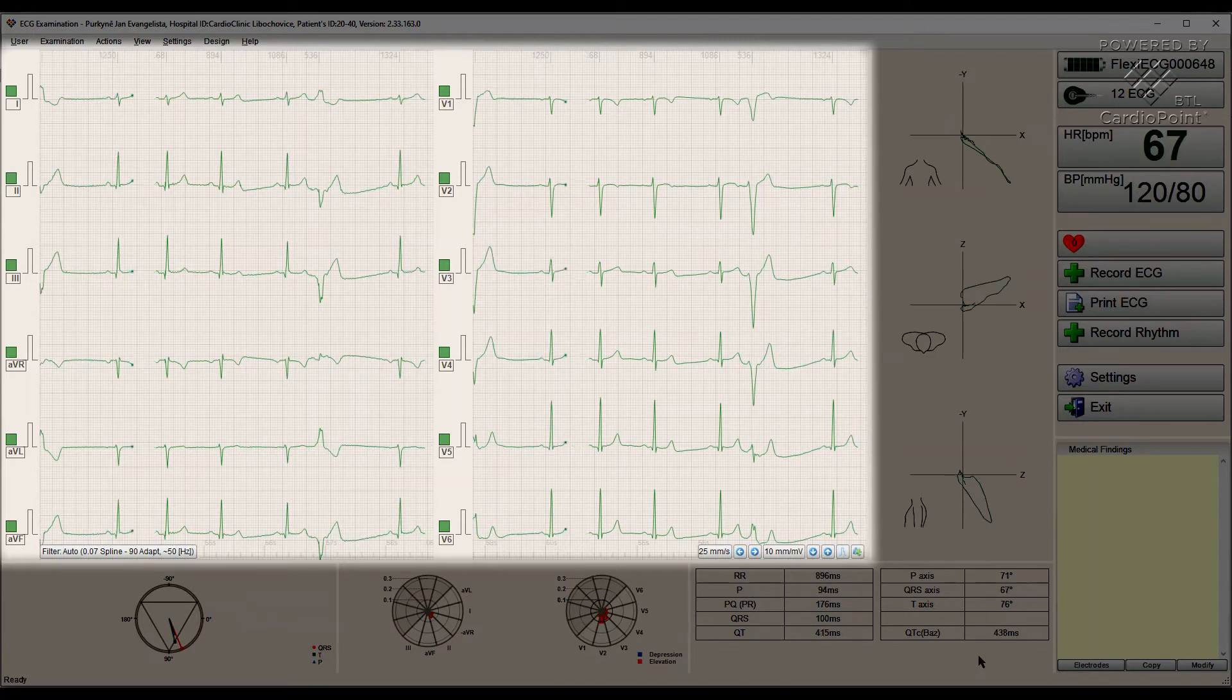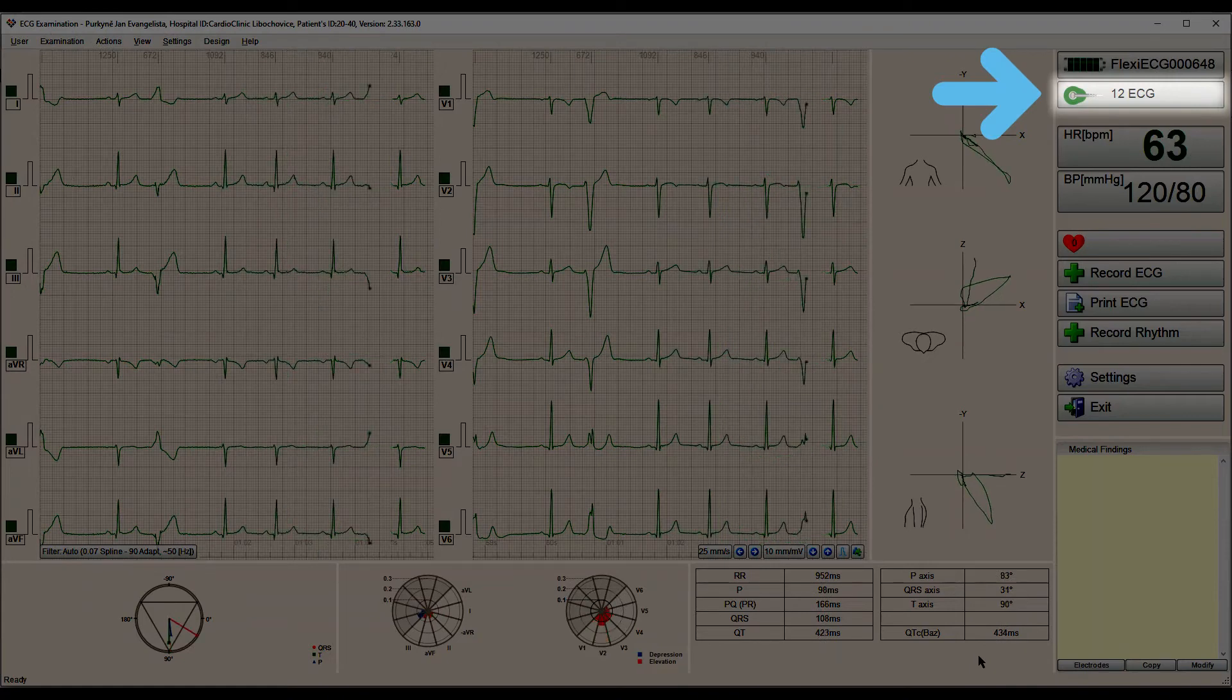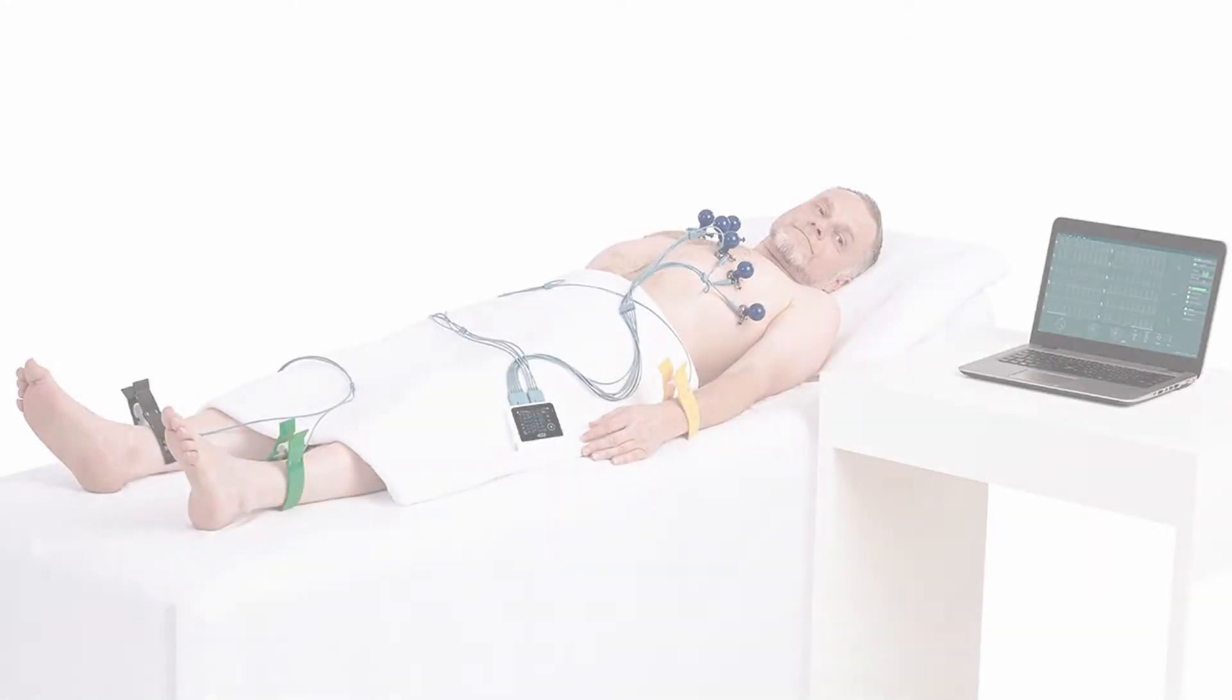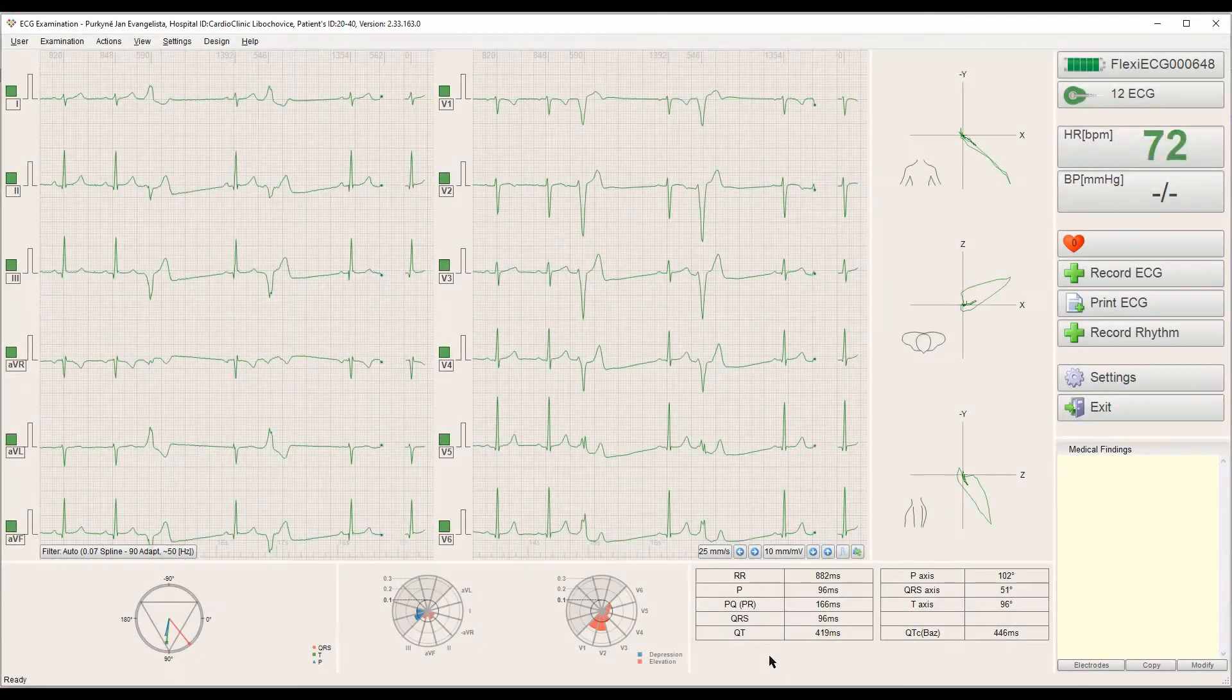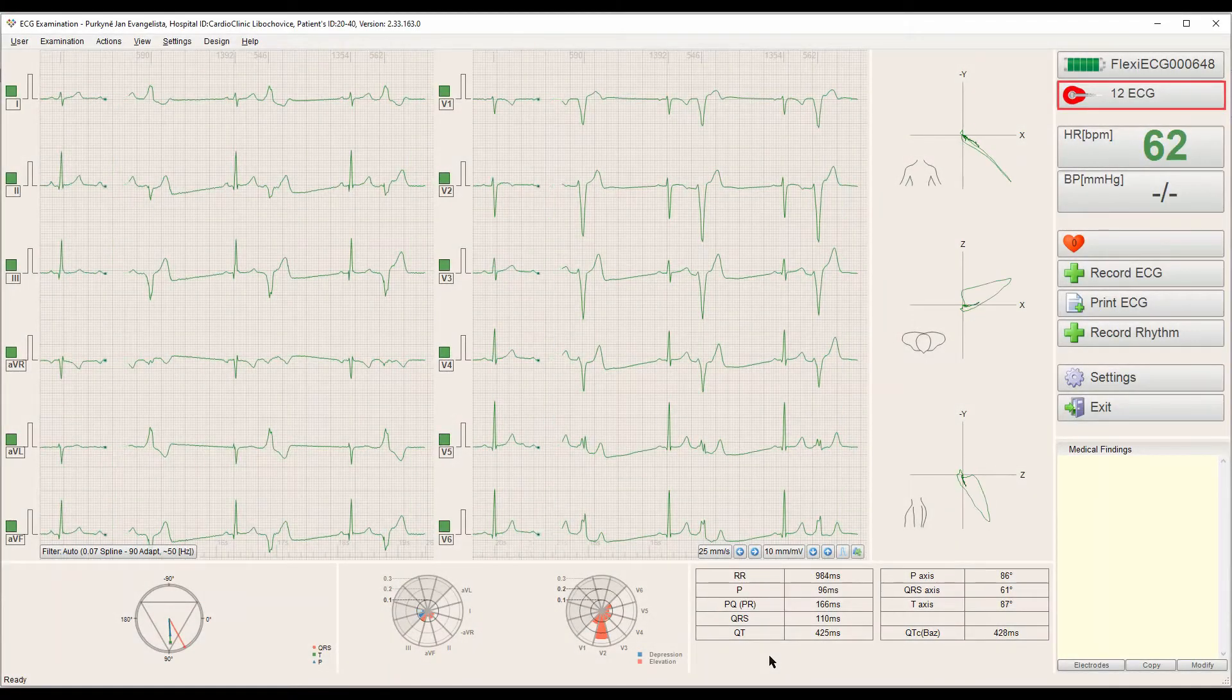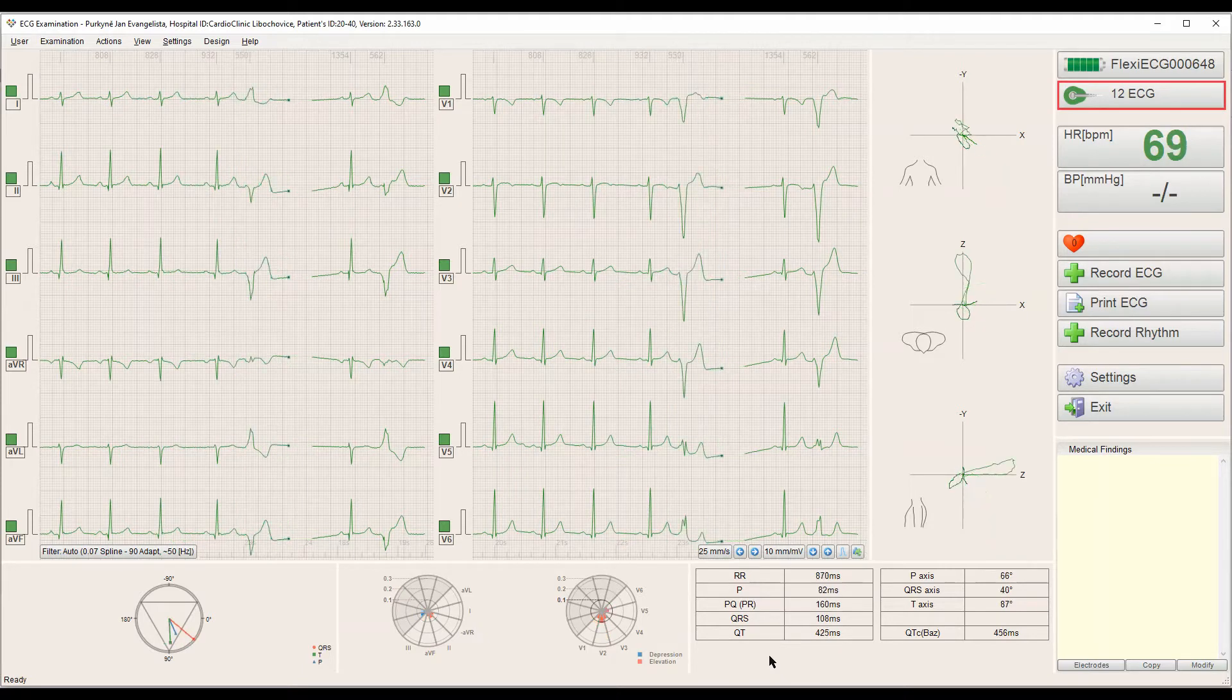On the right side, we can find the signal quality assessment which tells us if our electrodes are attached properly on the body of the patient. Double-check them if the color is orange or red. We can click the button to review the contact of the electrodes.